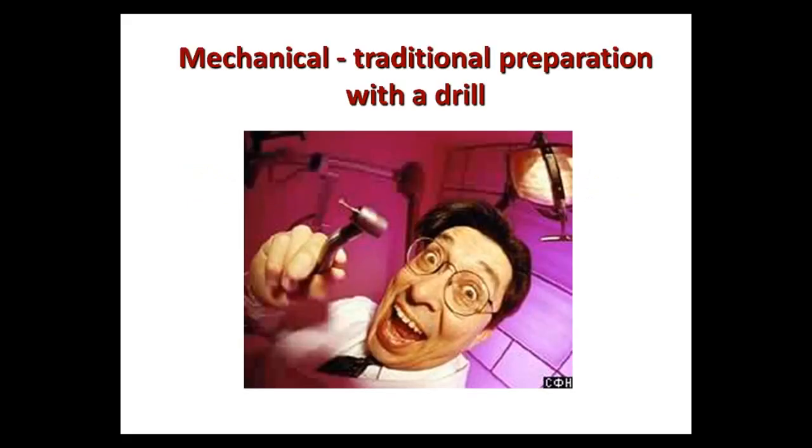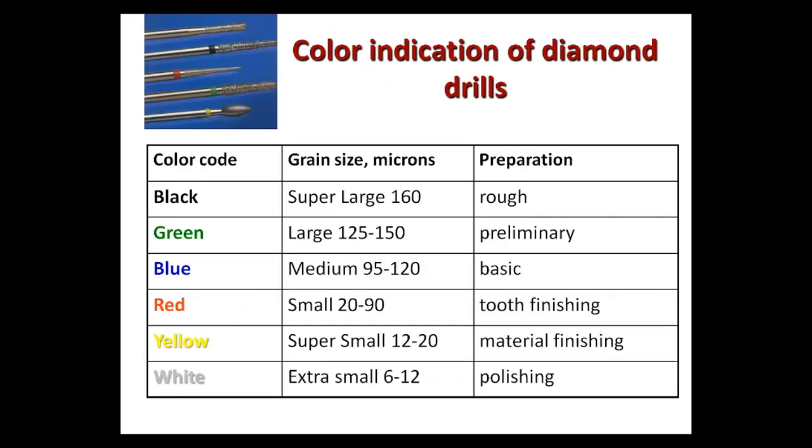It is the most often used preparation and is very widespread. It is mechanical preparation with a drill and drill devices. We use drills in various shapes and colors.